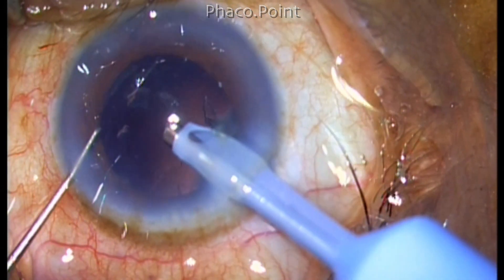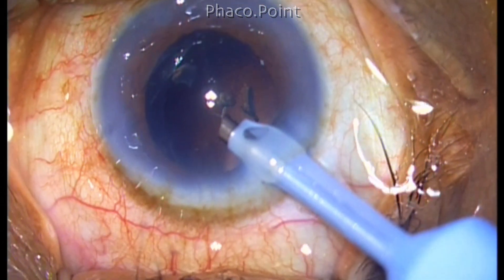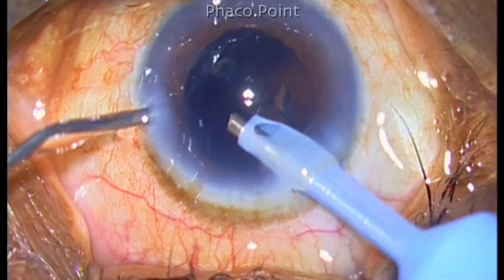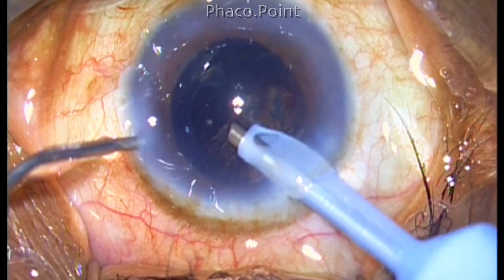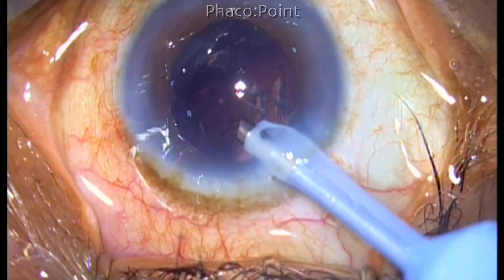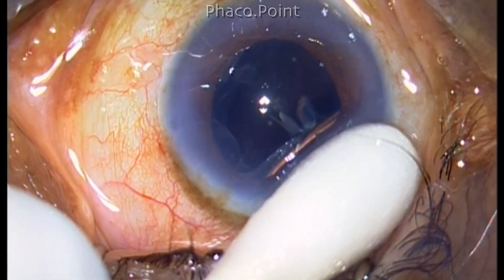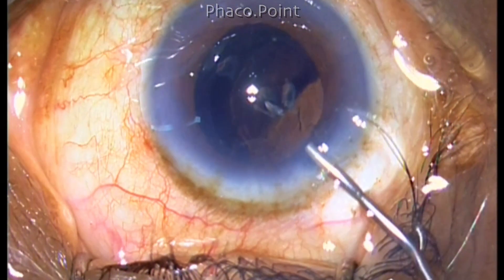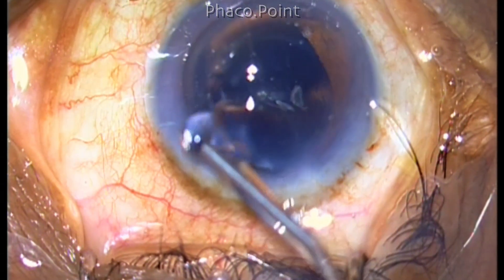At the end, I found there were three to four pieces of epinucleus at a much deeper plane than the posterior capsule. This is a very peculiar finding and they were remaining quite stationary. I do a viscofluid exchange before I pull the phaco probe out. I know that there has been a breach in the posterior capsule — otherwise these pieces would not have gone behind. Are they in the anterior vitreous or is it that they are in another plane altogether? I'm not able to tell for sure.